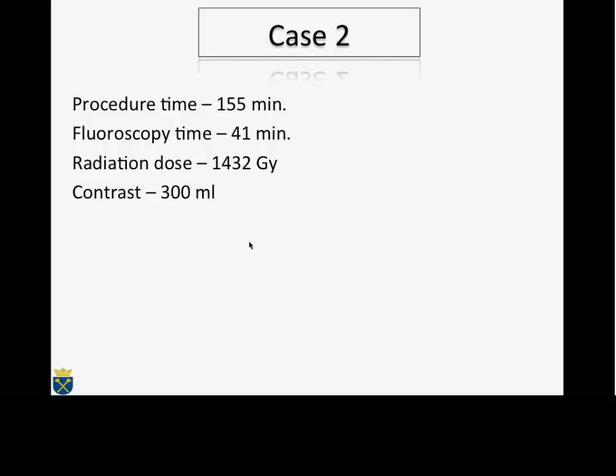Yeah, absolutely. And you say it can be the end of the case or the beginning of the case, but I think what you showed us very nicely is that having a dissection on the antegrade route may not be as bad a thing, and you can always find ways to deal with it and get a successful result as long as you persist and know what you do. So that's a very nice demonstration there.